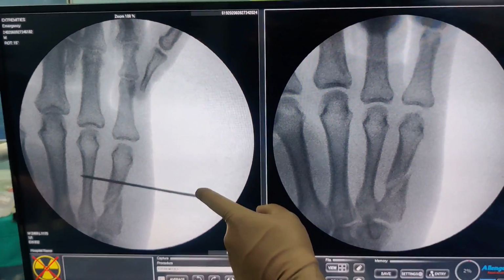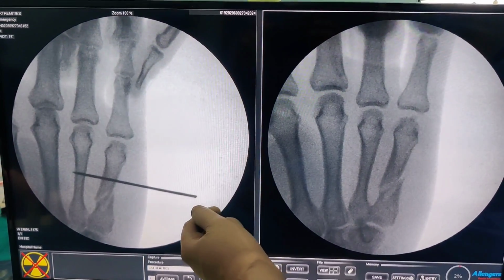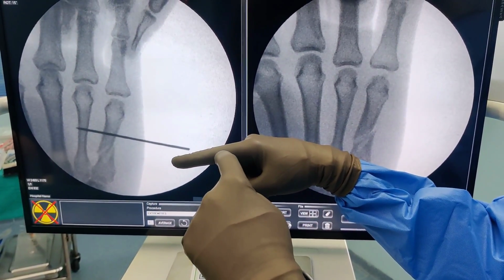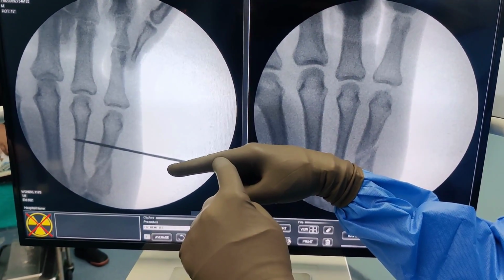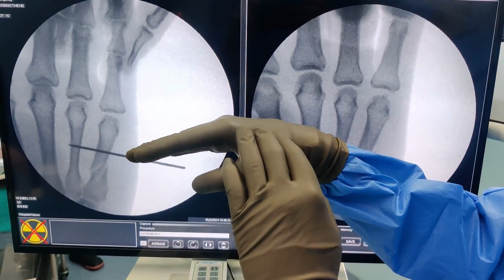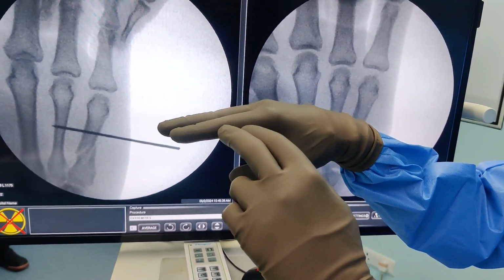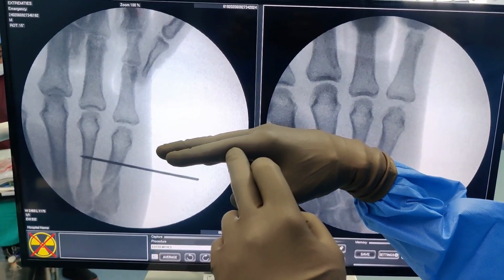So what I meant was, I usually take a wire in hand because then you are able to feel the shaft. So if this is your metacarpal, then take the wire and you can feel the top and you can feel the bottom. Try to be in the center. And because the metacarpals make a dome, the fourth metacarpal is slightly anterior. So if this is, for example, the fifth metacarpal, the fourth metacarpal is slightly up. So you need to angle slightly up.